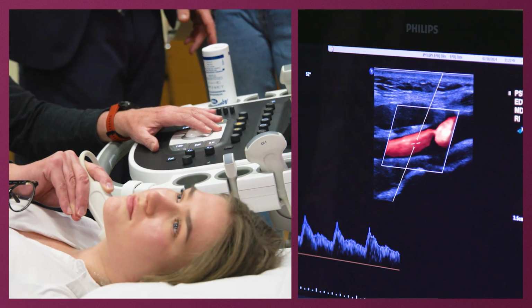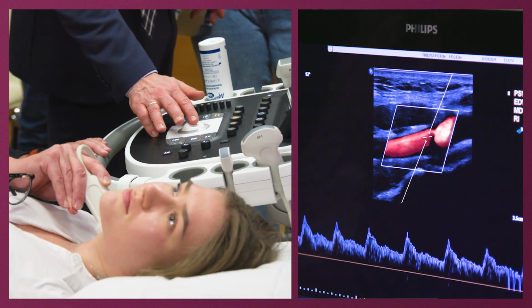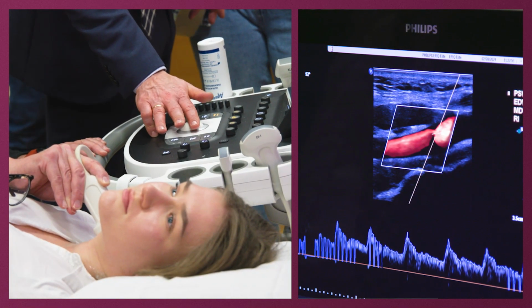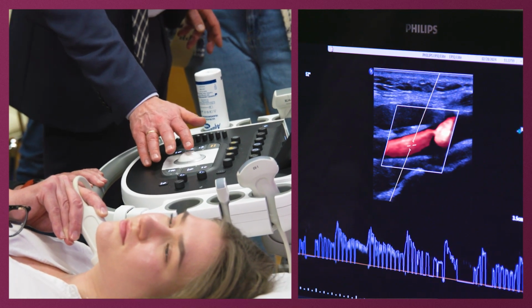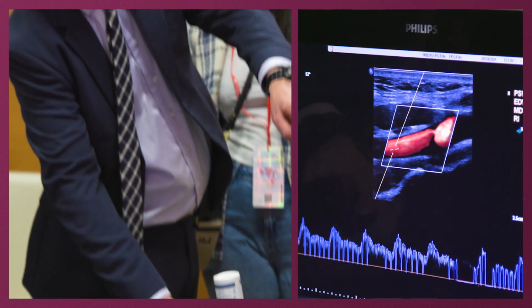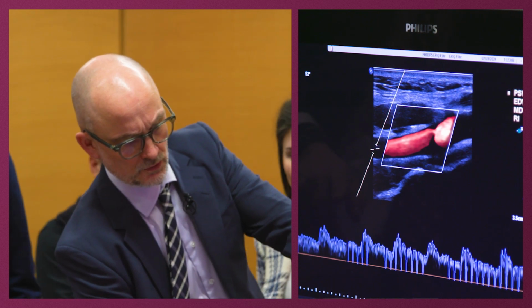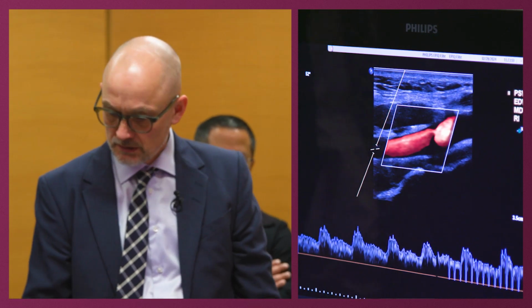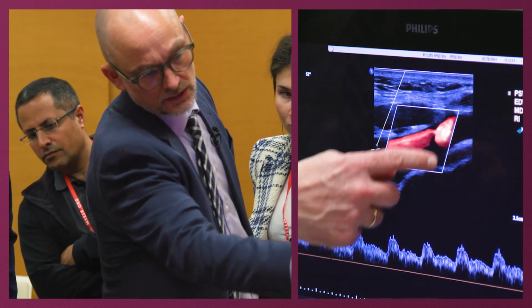And in a case like this, you need a steady hand. Then I do what I call walk the Doppler. It's a quick way to see if there are any velocity increases here. I'm looking at the curve and at this at the same time. Does it work also for low velocities all the way? It works also outside of the box. Yes, this is it.